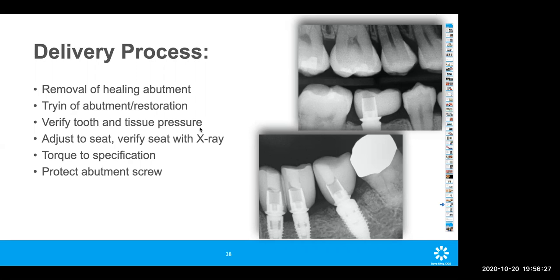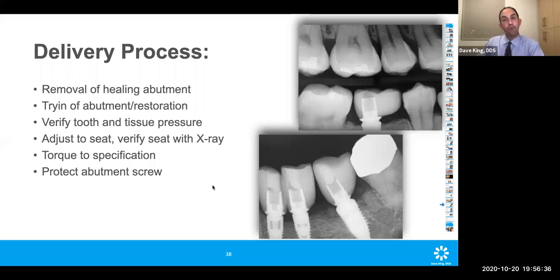All right. And in your experience, have the porcelain crowns been able to withstand occlusal forces and not crack, or are PFM implant crowns stronger? So it depends on how you're testing it. In my experience, the crowns that you're seeing here are all lithium disilicate, EMAX. And with the thickness that we have here, even this narrow thickness on the one side, I personally am not concerned. Now, have I had some fail? Sure. But I've also probably had an equal number of PFM crowns, whether they're implant crowns or otherwise, that have lost some of the porcelain. So I think if it's managed appropriately, just about any material, given it's appropriate in this indication, can work well.